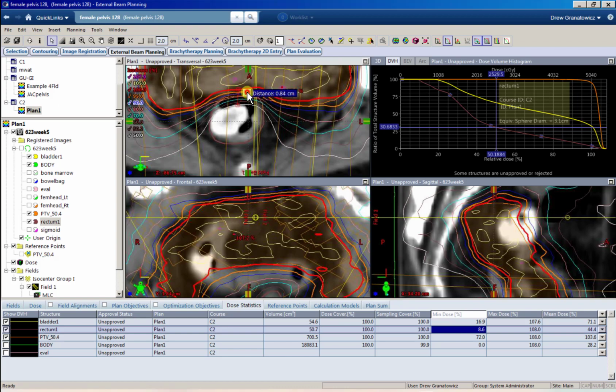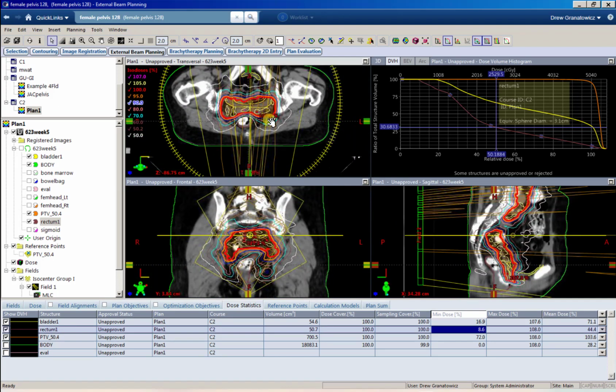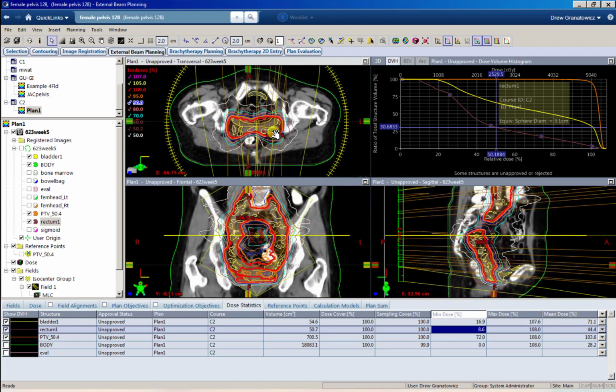All right, so pretty good. So keep that in mind. 5 to 10% per millimeter is what you should be shooting for. The larger the volume you're dealing with, the closer to 5% you'll be. The smaller the volume and the more round that volume is, you can look closer to that 10%. Okay, for conventional fractionation, for SRS, SBRT, you can usually do better than 10% even, but for conventional, 5 to 10%.